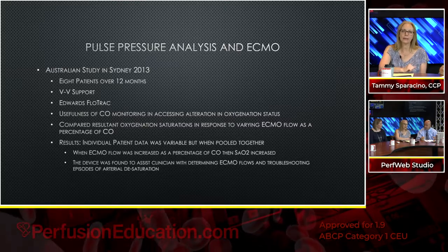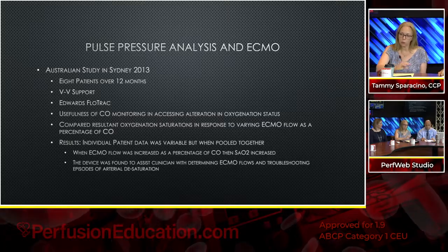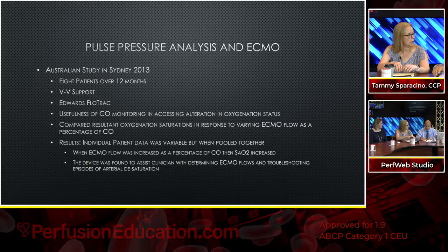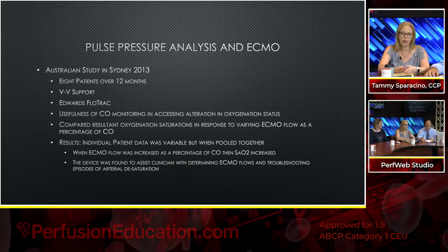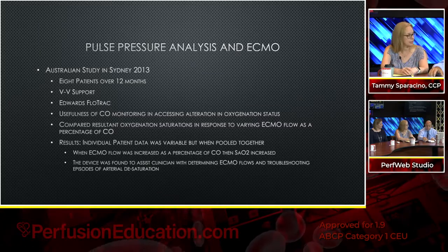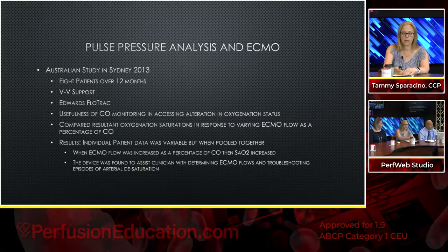Again, they only had 8 patients. True. But they did find that with all of them, once they were pooled together, if they saw a desaturation and increased flow as a percentage of the cardiac output that the FloTrac was reporting, they did have the appropriate response. Okay. Kind of interesting there.